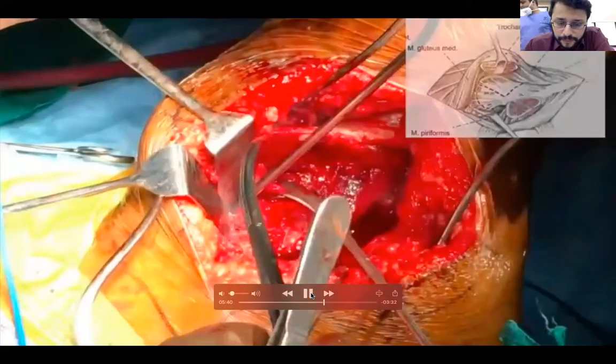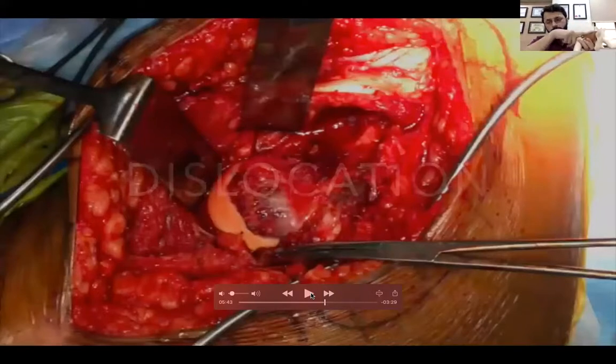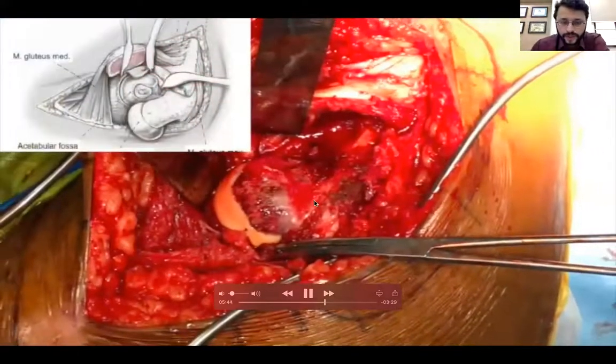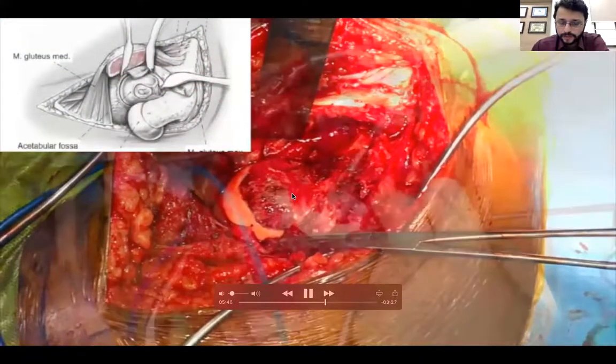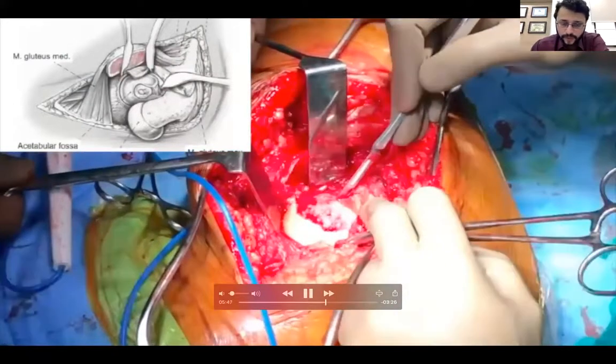This is a superior cut. So just to explain, if you have the anterior hip, the first cut is here, the second cut goes right here, and the third cut is here. So it's a Z-shaped capsulotomy which we create, so as to create two flaps. Once we do that, we dislocate the femoral head anteriorly, right? Now what we usually do is fix the head with two K wires temporarily when we are dislocating. So I unfortunately missed that in this video.